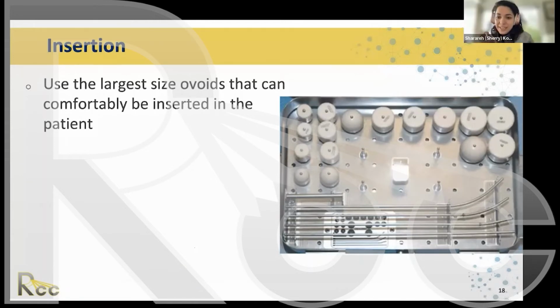Yeah, thank you. And Yvonne is asking, sometimes there's a lot of blood while inserting the tandem. Can this be due to perforation? It can be due to perforation. It can also just be due to irritating the uterine wall. So I don't think it's a definite indication of perforation, but typically there's not a ton of blood. So if there's a lot of blood every time, then that may be indicating that there are perforations happening.